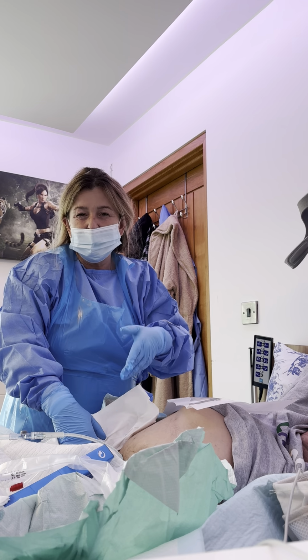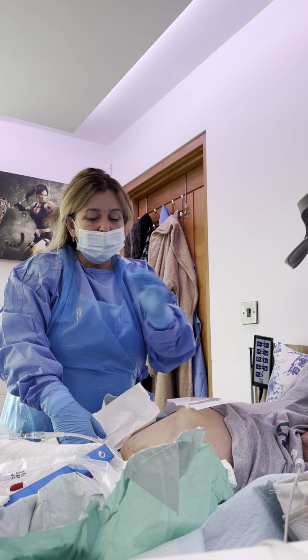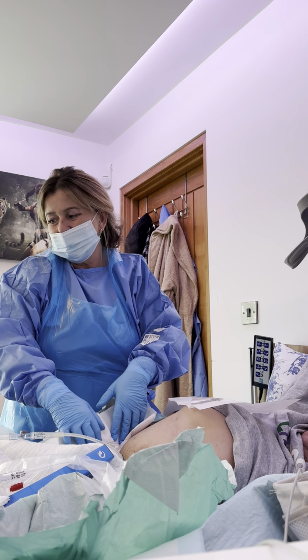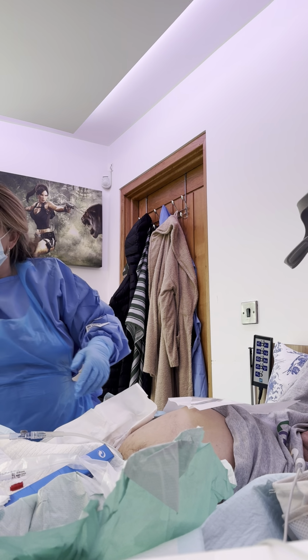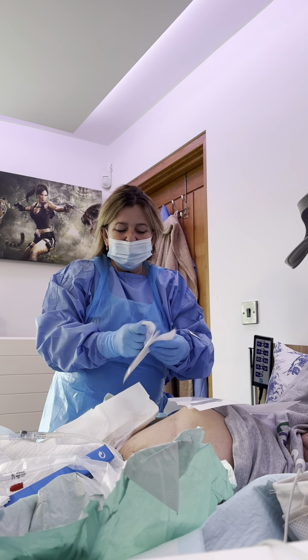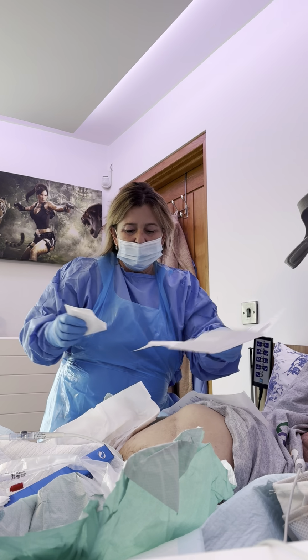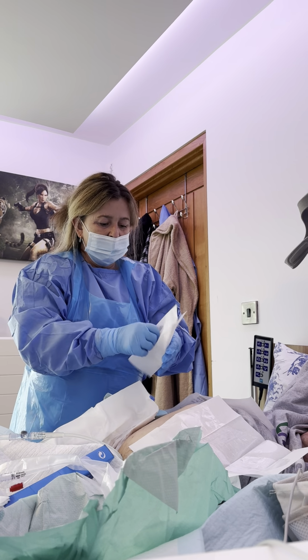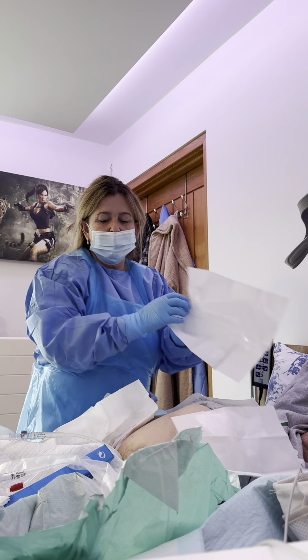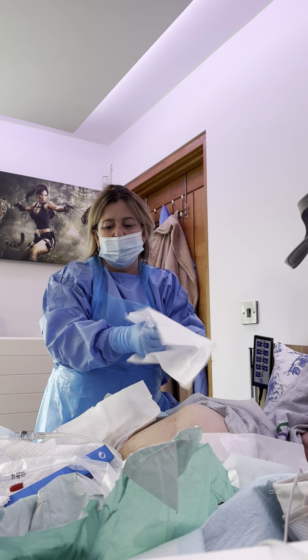We're probably going to get a retention. The urine's going to pop. I've got a pad ready for that, and I'm just going to go straight in. I'll try and talk it through, but sometimes when you're talking it through, things go wrong. Like I said, I would have loved to have done this live, but I obviously can't, because I just need to get it out and get a new one in. I've got 2 hands, and you'll see the reason: one clean hand, one dirty hand.